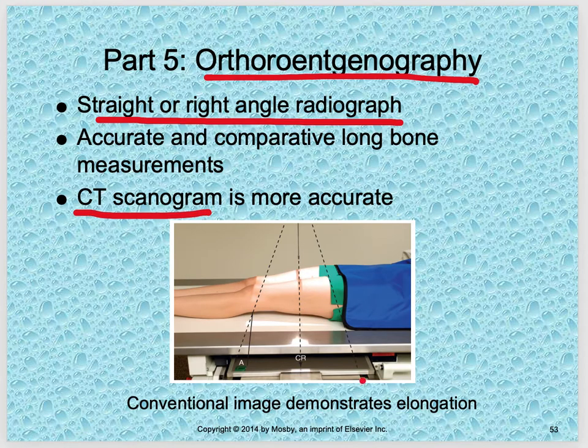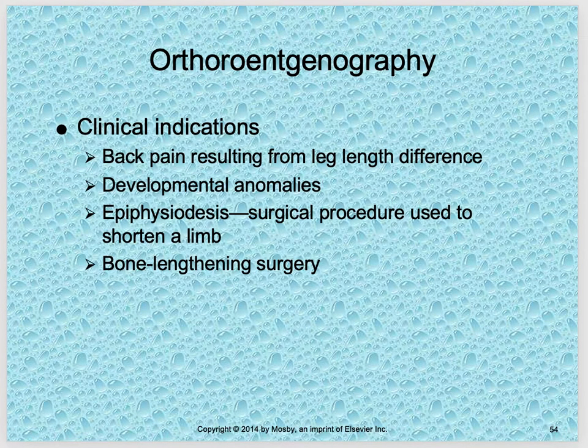So the central ray, and then it's going to image that entire long bone, and you're going to have a tape, a measure stick within that image so they can compare the length.